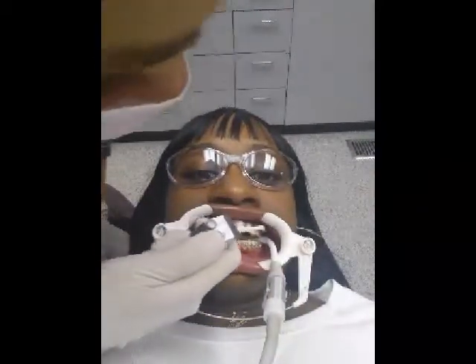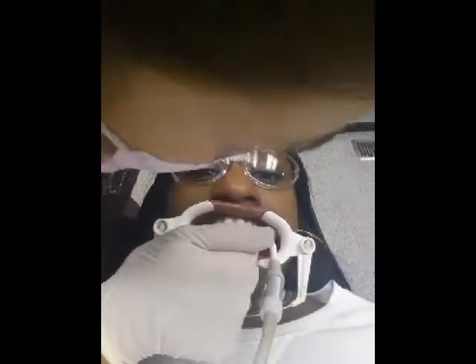And after she's done, she moves on to the top set of teeth, and she pretty much does the exact same thing. She cleans it thoroughly with the blue stuff, whatever that's called, and rinses it off, dries off each tooth really, really well, and then places the brackets.